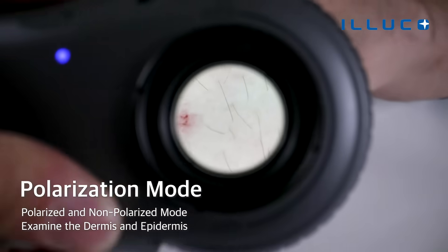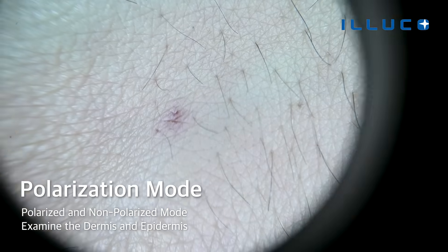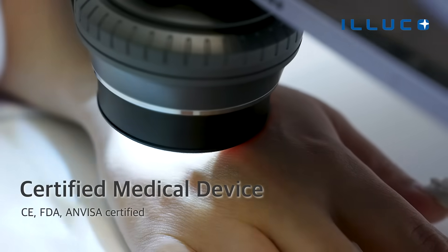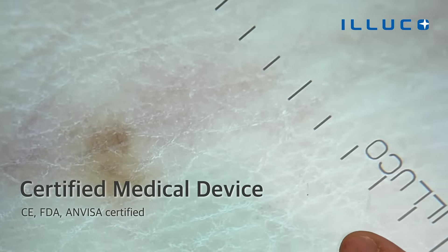You can comfortably examine the dermis and epidermis layers of the skin by utilizing the polarization mode. As a medical device, IDS 1100 has been certified to meet several authorized safety standards such as CE and FDA.